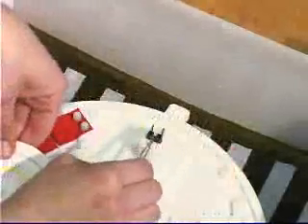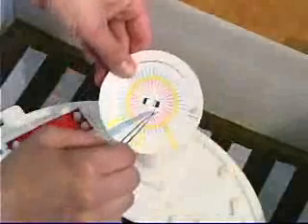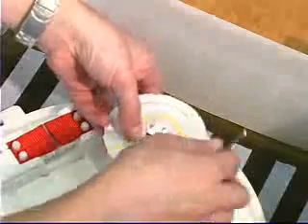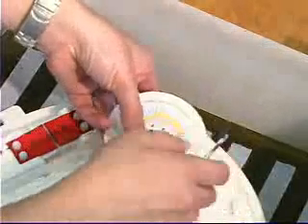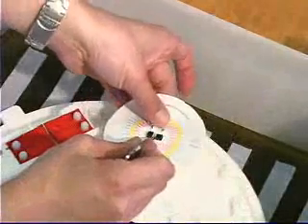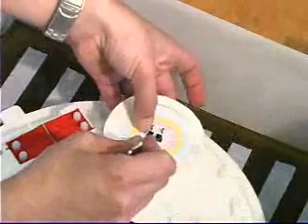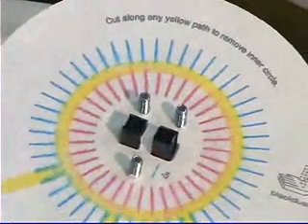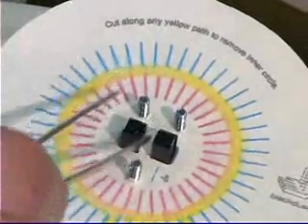It also has 3 perforations which fit into the pins on the pod. The tabs must cover the inside area in the pod in order for the completion of the task to be sensed.